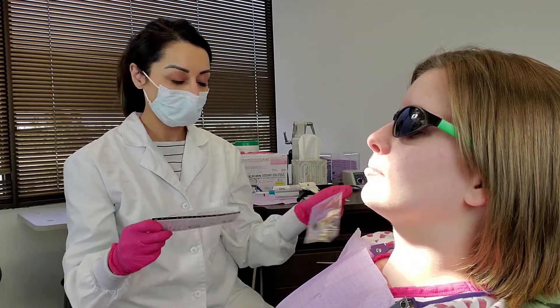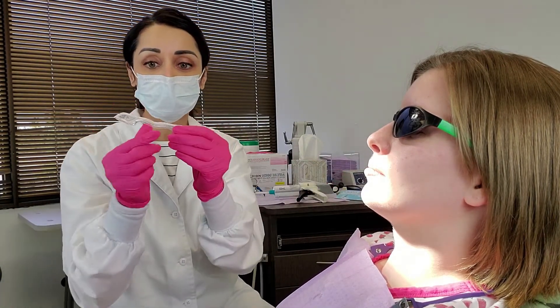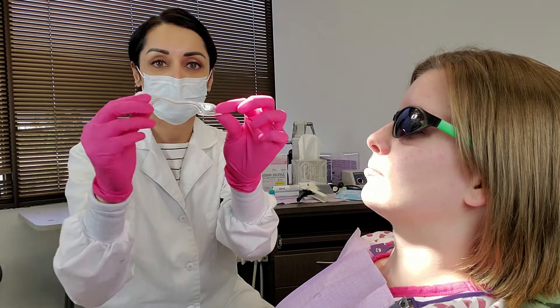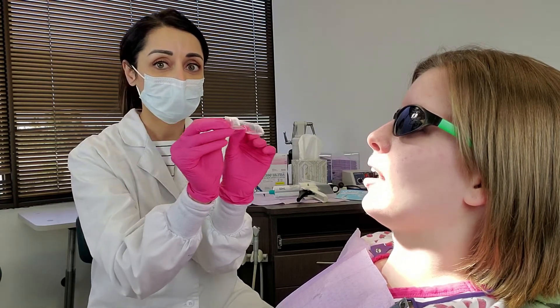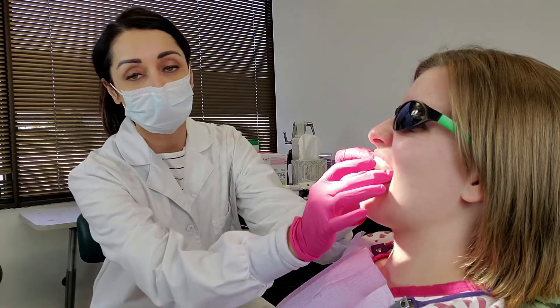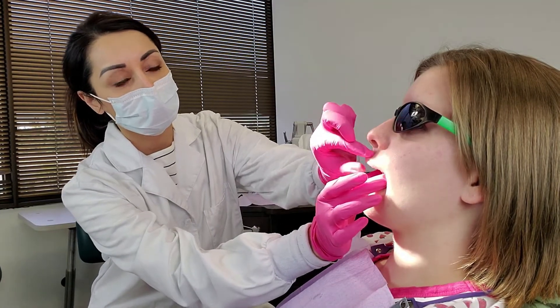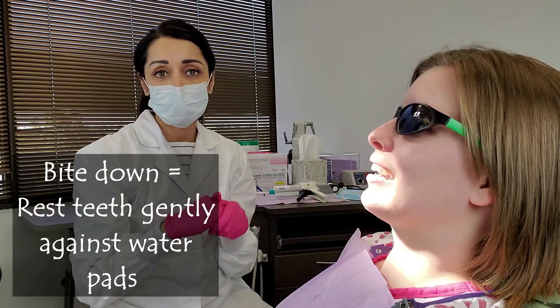You just open it up and take it out. What you want to do is have the pads facing away from you — these little water pads are facing away from me — and bend the whole thing into a horseshoe or arch shape, again with the pads facing away. Then you insert it in the mouth with the pads way in the back. This top part bent into the horseshoe shape has a soft liner, so it's somewhat comfortable. Then I'll gently pull her upper lip over that and ask her to bite down, and typically ask patients to stay biting for about 20 minutes.